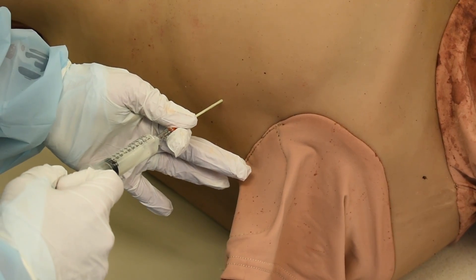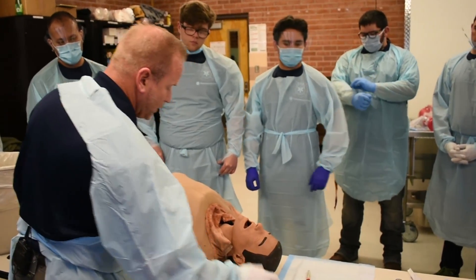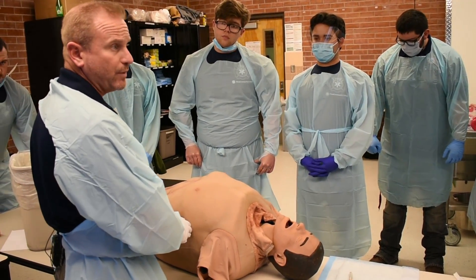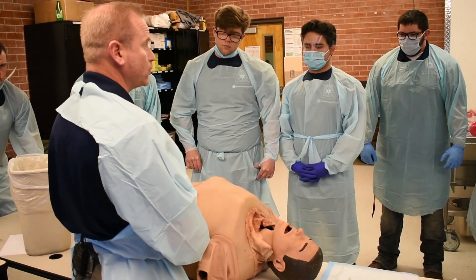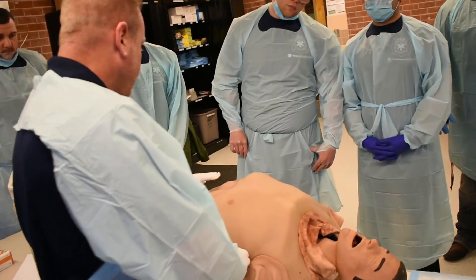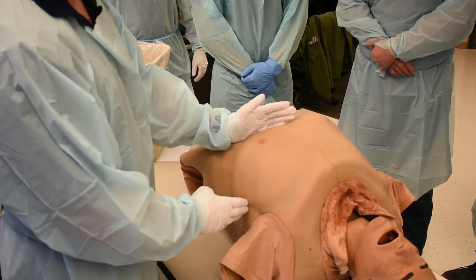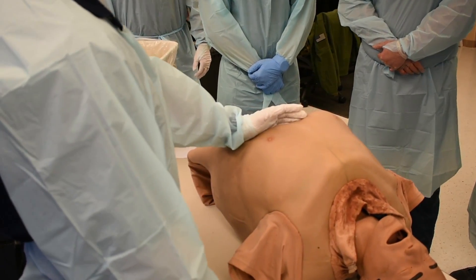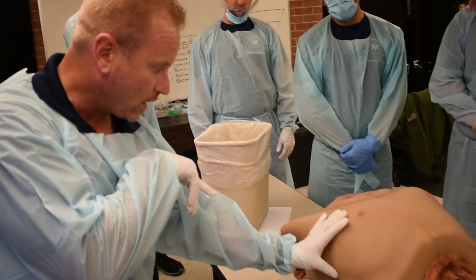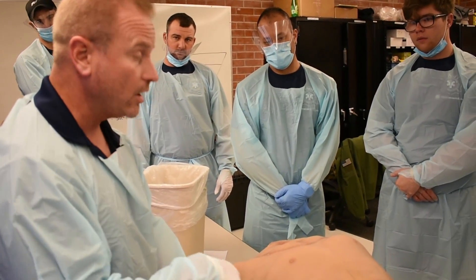If it's a term pregnant patient — it's an MVA, maybe she had a crush injury and she's term — we just move up one rib space, third or fourth intercostal space, and you're not going to hit the baby. As she's at term and her fundus is pushing up on all structures, it pushes up on her diaphragm — you want to stay third or fourth so you don't inadvertently put your needle through the diaphragm. On the left side, if you angle down, you could hit the spleen.